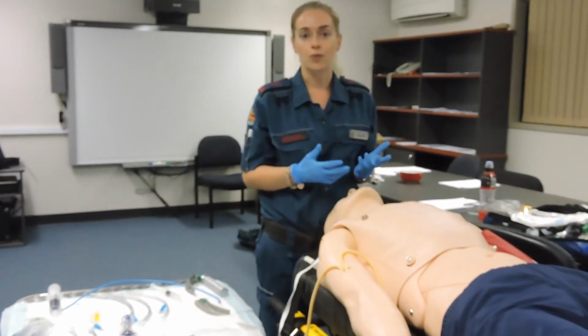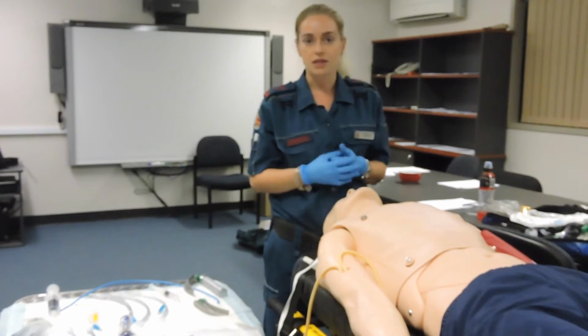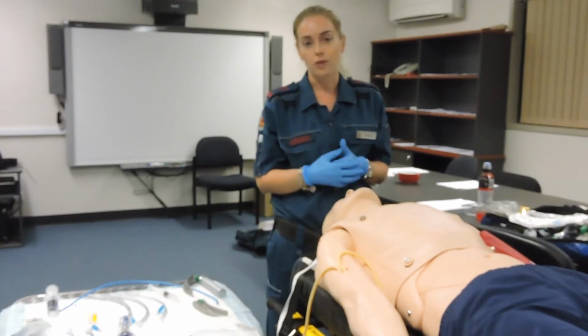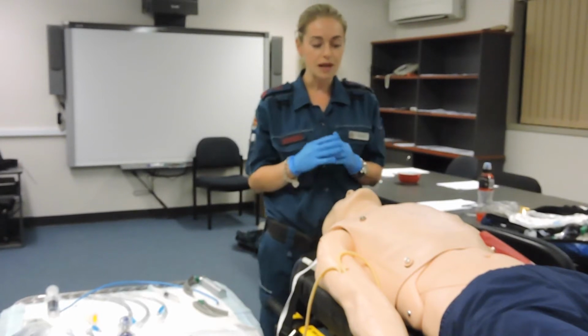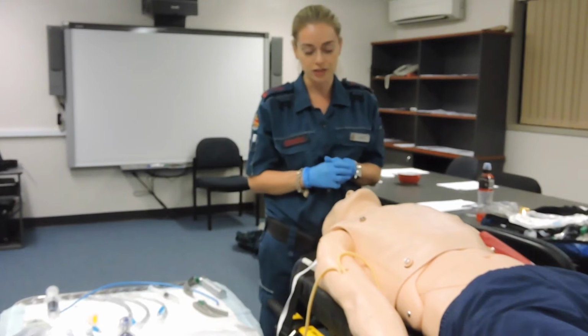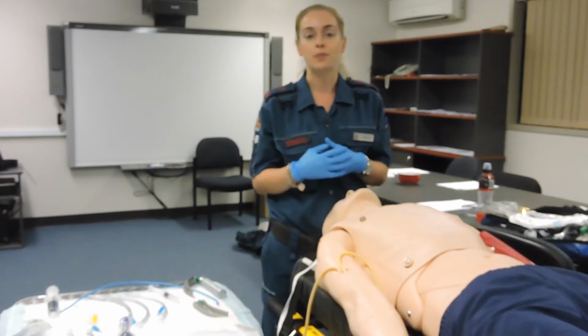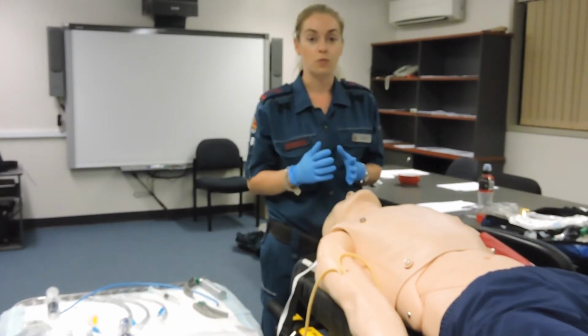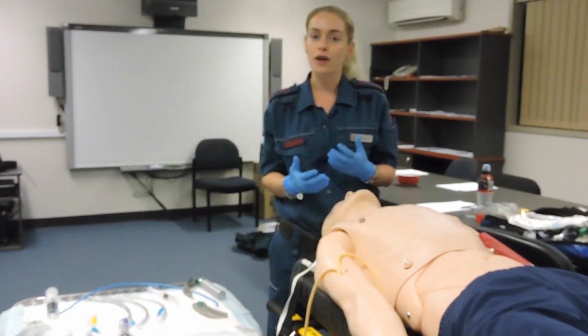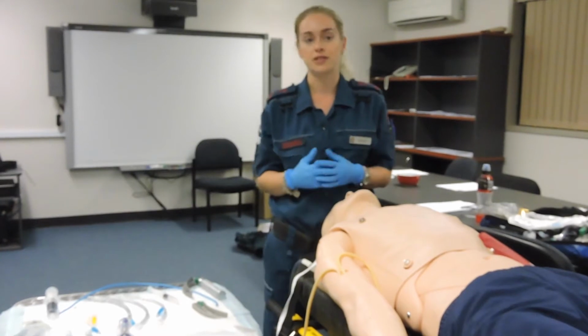In Queensland, the HARU CCPs, which are skilled CCPs that get additional training and skills, are the only ones that perform an RSI. Every time an RSI is done, you are at risk of a can't intubate, can't ventilate situation, and therefore it's very important to brief your team on what will occur in steps as per the failed algorithm. So before I demonstrate this for you, we're going to go through those steps.